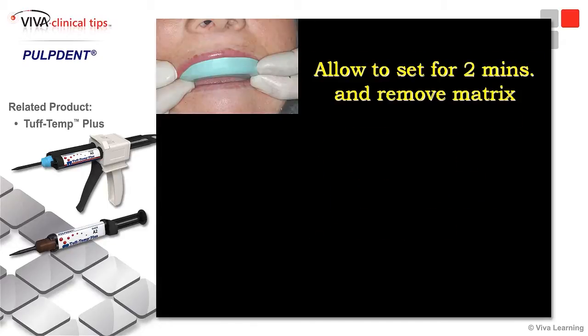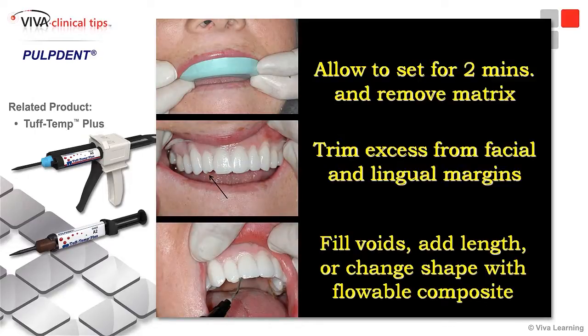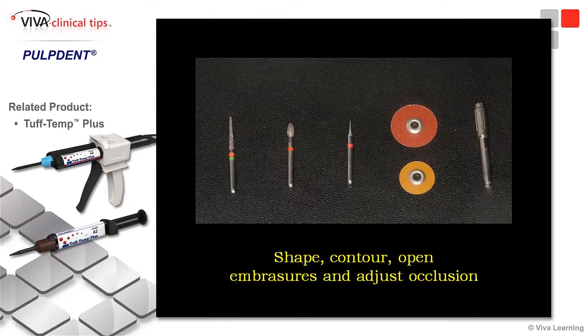After it's been in for about two minutes, we're going to remove the matrix and we're going to see our temporaries. We'll see a little bit of excess gingival, and every now and then you might get a little void or a little bubble. We can take some flowable composite — most of these temporary materials have a compatible flowable composite — and it's really easy to fill these little bubbles or voids in. Then we're just going to shape these and trim away the excess.